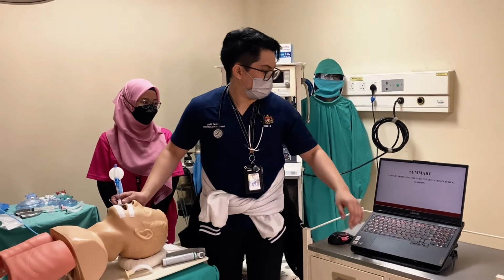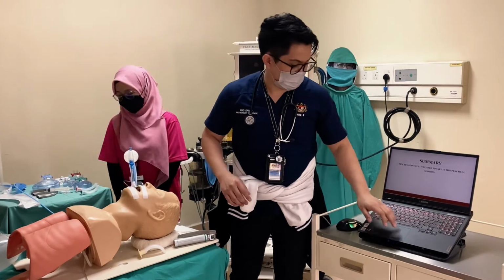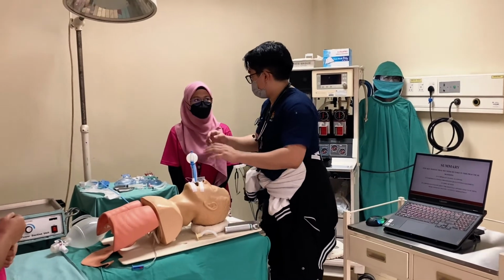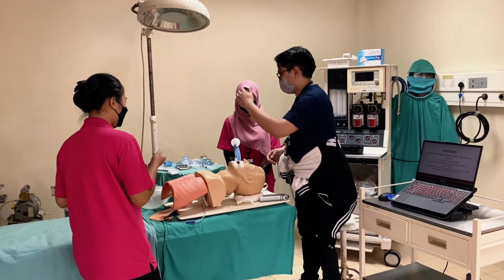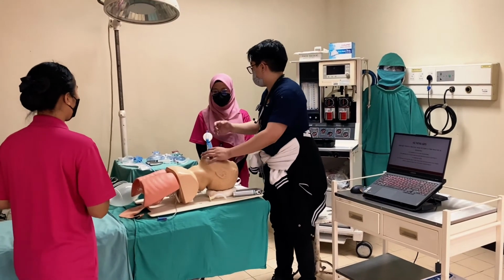And in summary, a few key points that we need to take from this practical session. It's important to have teamwork. When we do this, we know what our role is. As I said before, one person gives the drugs, one person is a runner, and one person is an assistant for us for every procedure.